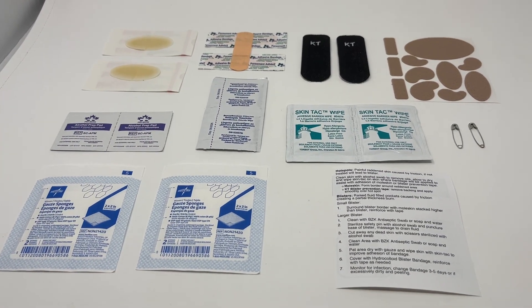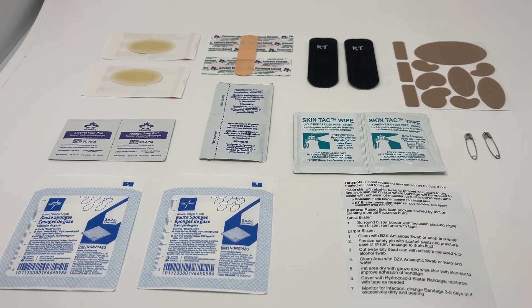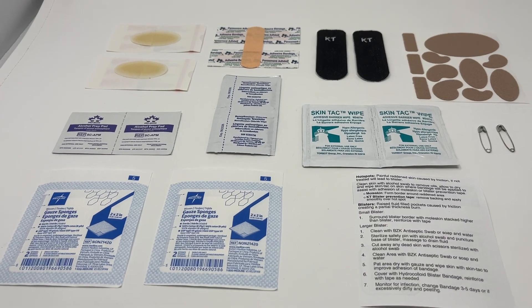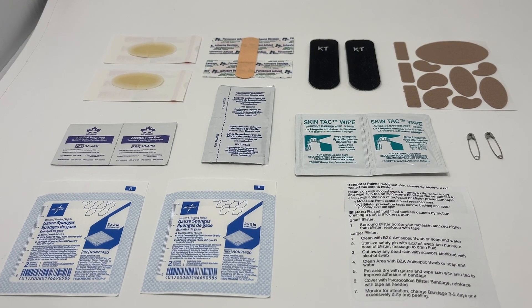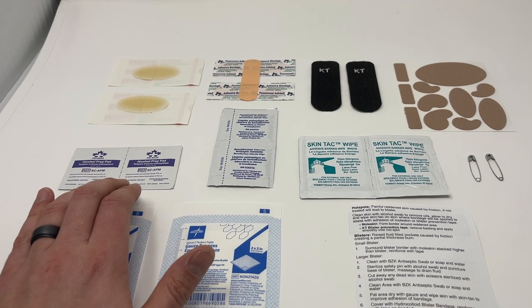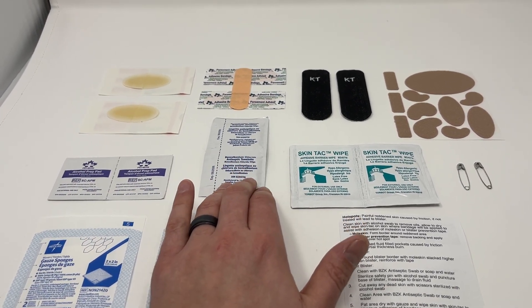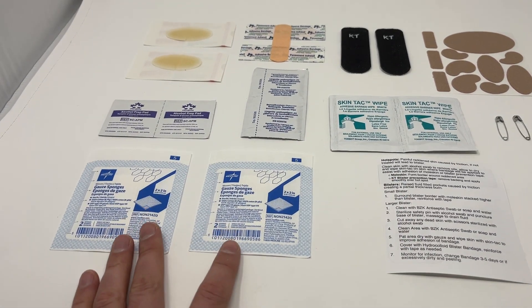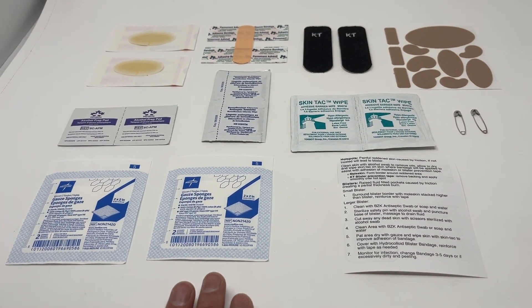One of the big things for everybody is prepping the skin before you're sticking anything on. Feet are inherently difficult to adhere bandages to, so we've included all the products to really improve that bandage sticking properly. First, prep the skin with alcohol prep pads — that removes the oil and the dirt. You can also use the BZK swabs around any open spots; this won't damage good tissue and it's not going to burn. Use the gauze pads to wipe everything away and dry the skin before adhering anything.